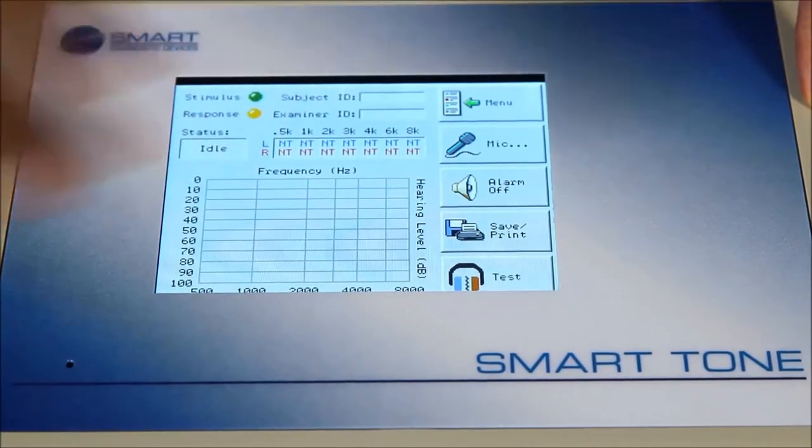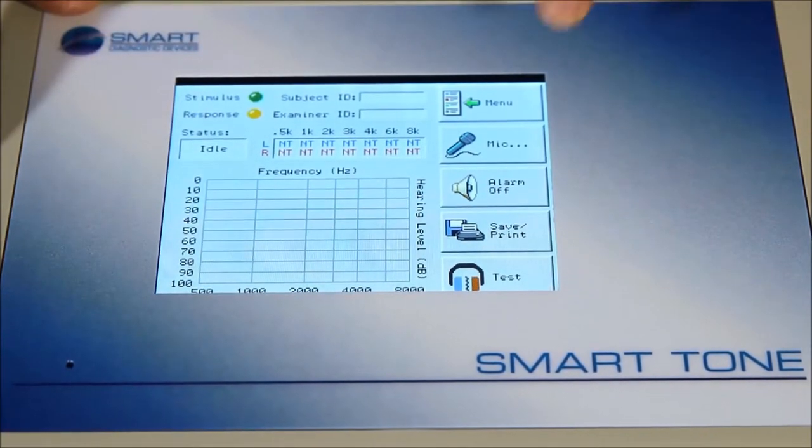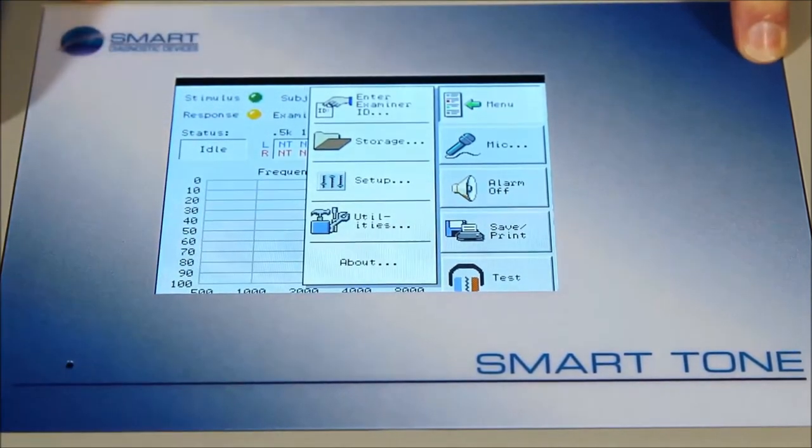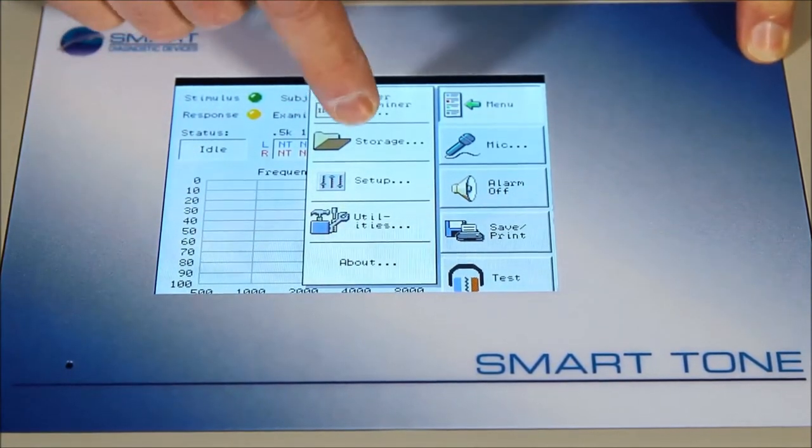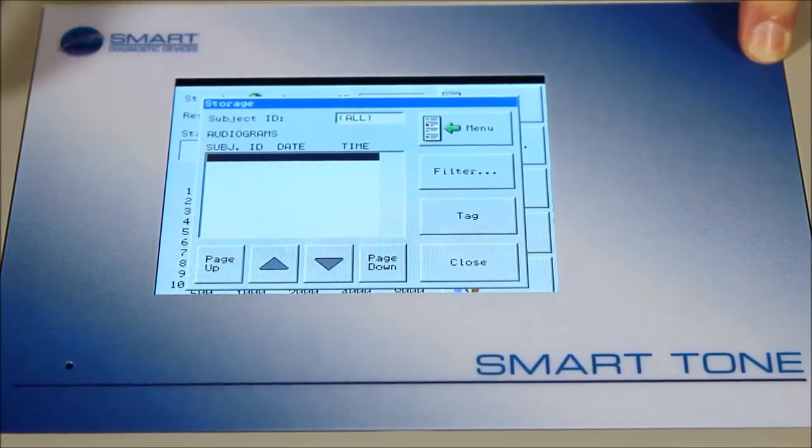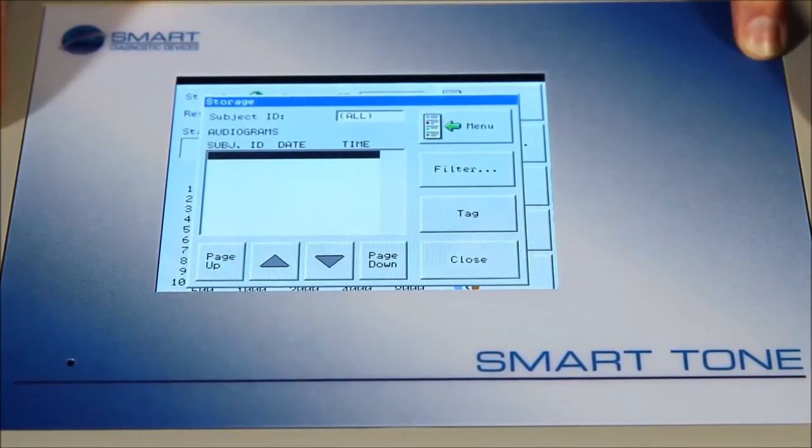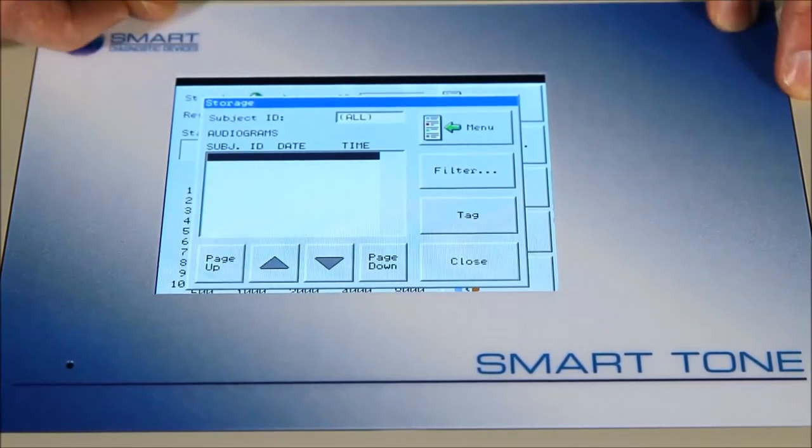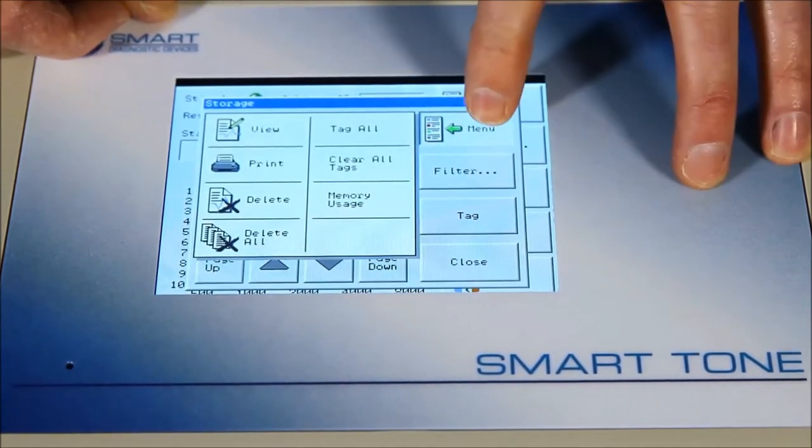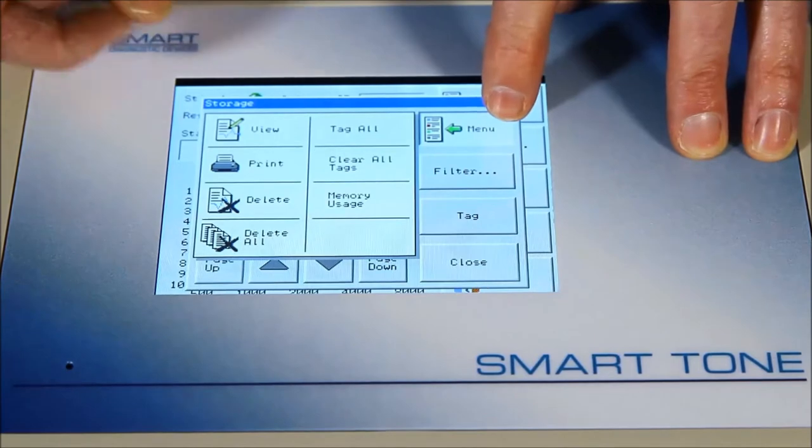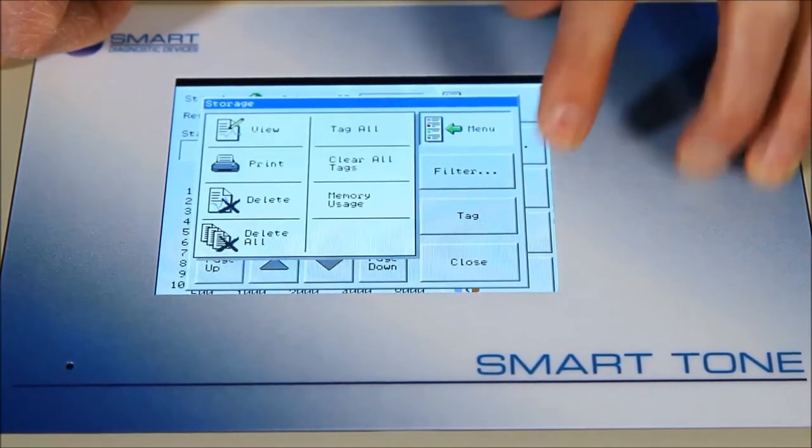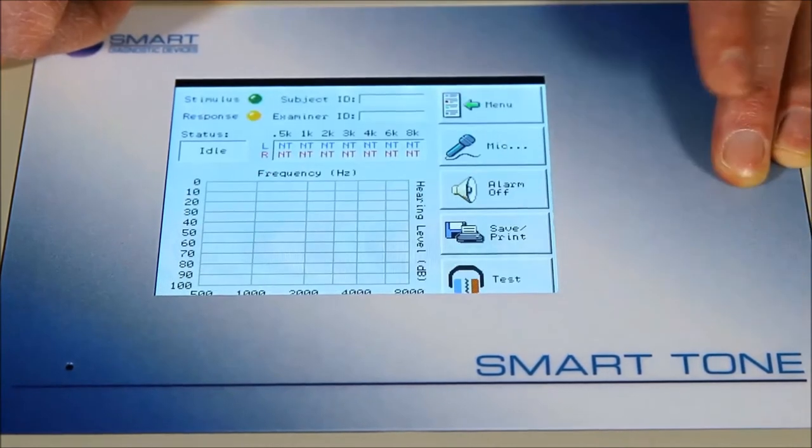I'd just like to show you the functions of the audiometer itself. Under the main menu button, there's a number of things we can set up and use. For example, your storage. Like I mentioned earlier, you can store up to 300 completed tests. If there's any tests stored in there, you can scroll through them, recall them, or delete them. I'll close that screen just so you have a look at that.